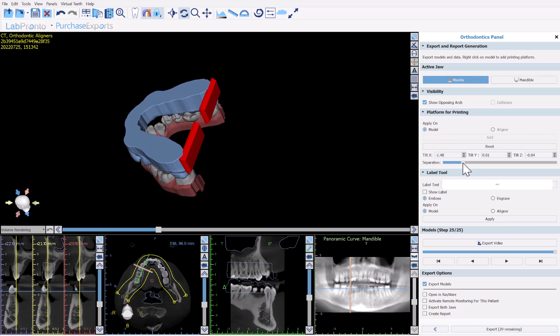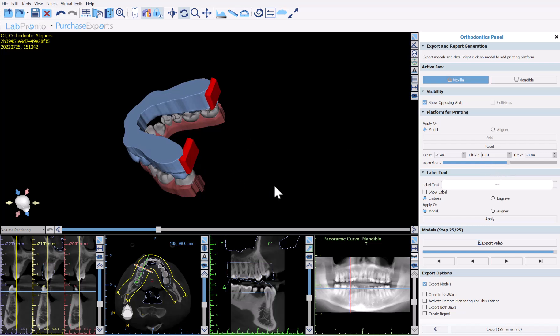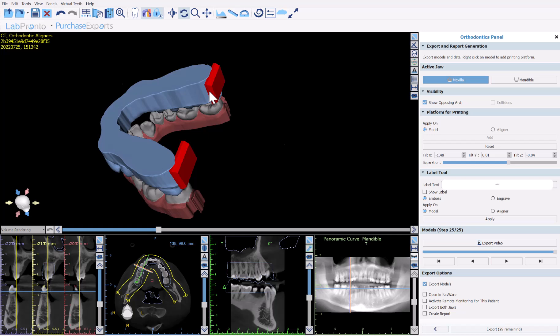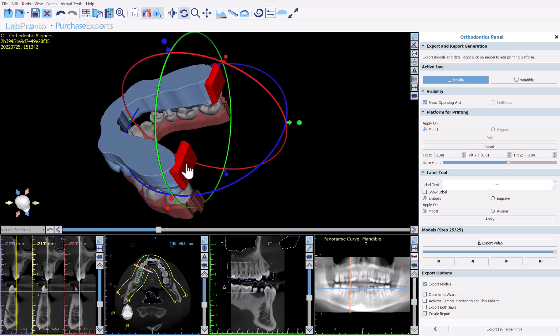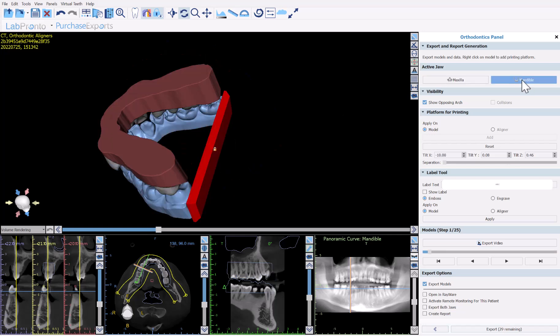We can also control the rotation of the platform manually using the values provided. We have the ability to separate the platform — the idea being to have it just on the heels to reduce printing time and material. You can customize and fine-tune the platform placement for each jaw.